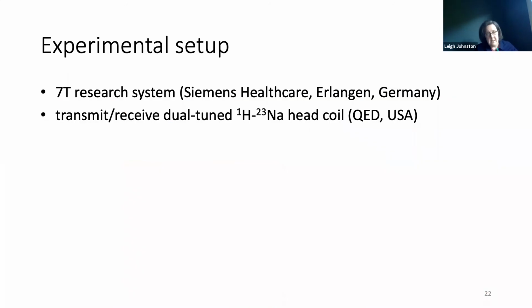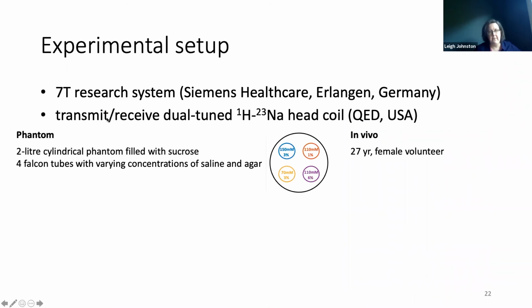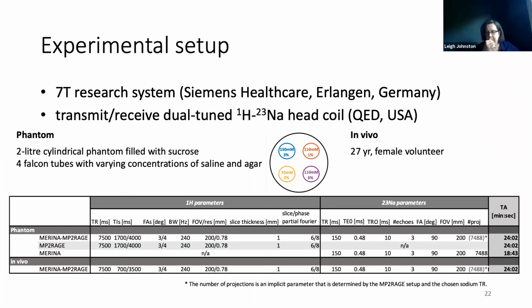So we tested this out with our 7T and our dual-tuned sodium proton head coil that I was talking about. We did phantom imaging, phantom just being a geometrically known object that gets put in the scanner. We varied both agar and sodium concentration, and we tried it out, at the moment, in vivo on one of our group members.